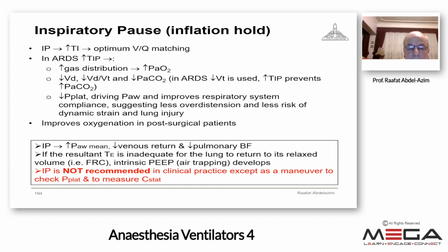Also, in pressure controlled ventilation, it is not usually seen. So during pressure controlled ventilation, if you want to measure the compliance and you want the pause pressure, you create a pause just to measure. But usually in clinical practice, it has no value in healthy individuals.